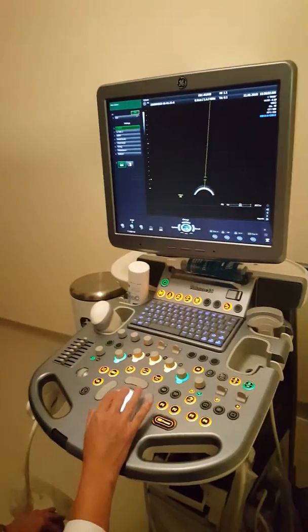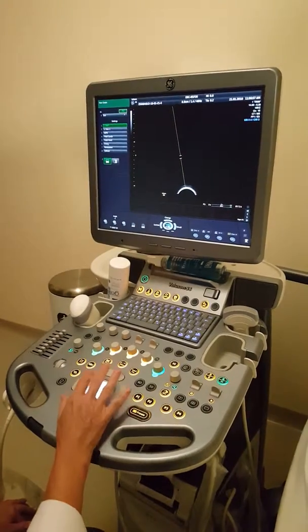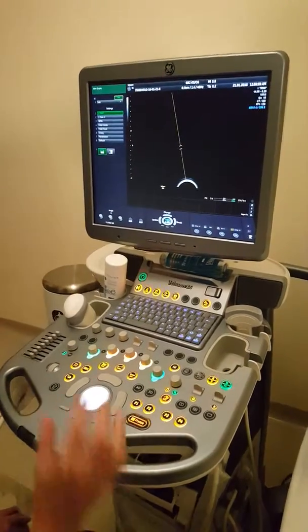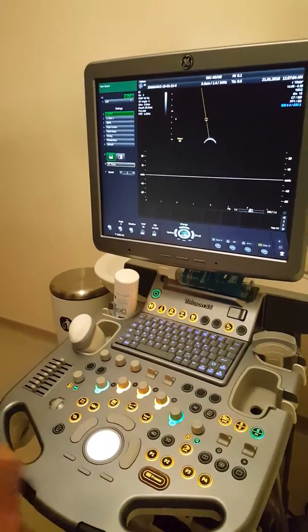Yeah, that's right. And then you go to the area wherever you think the heartbeat is. Set. That is what I always forget. And then I think, why don't I hear it? And I see it, set. Yeah, that's when you hear it.